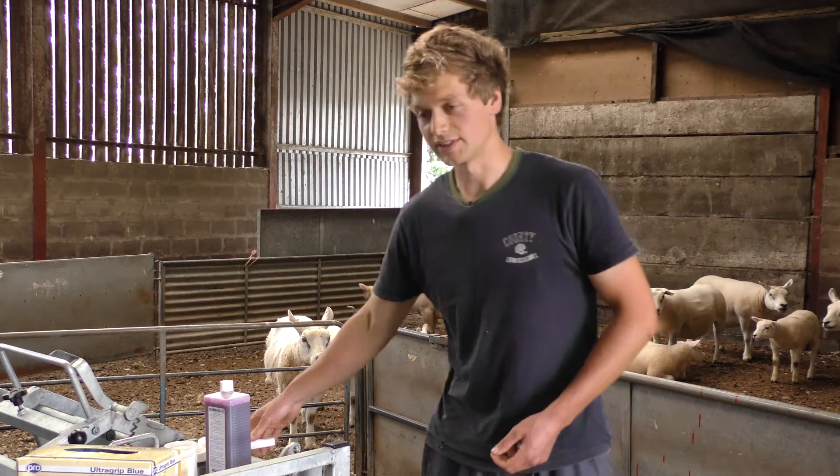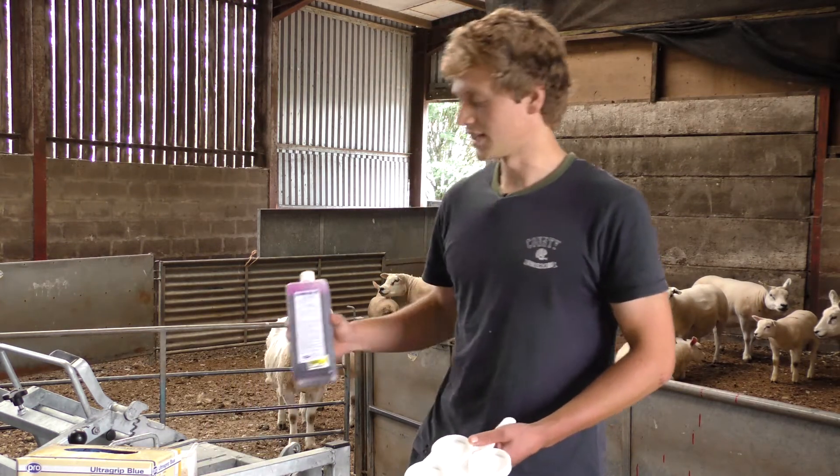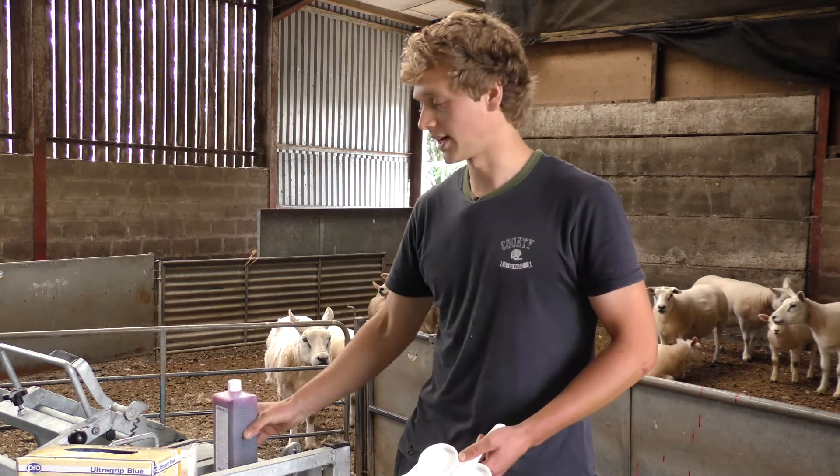So all you need for this test is a CMT paddle, like this, and CMT liquid, and gloves, of course.